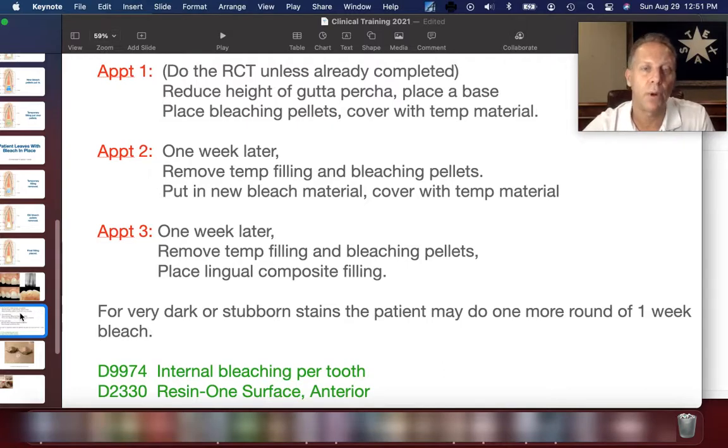One week later, appointment three — hopefully the final one — we remove the temporary filling and the bleaching pellets, and then place our lingual composite. If the tooth is pretty dark or needs another round, they can go with another round of bleach. It's very rare they would need three or more rounds, but it is possible if necessary. Usually one to two bleaching cycles works just fine.